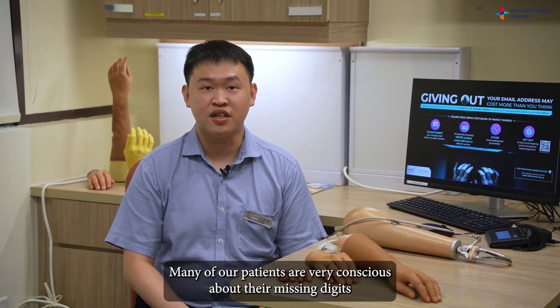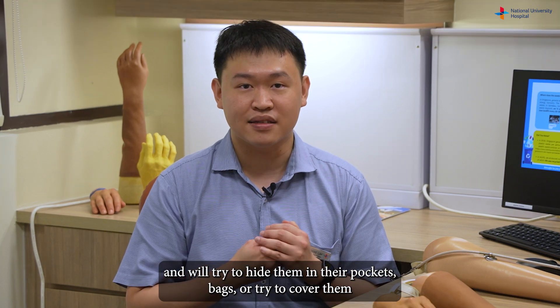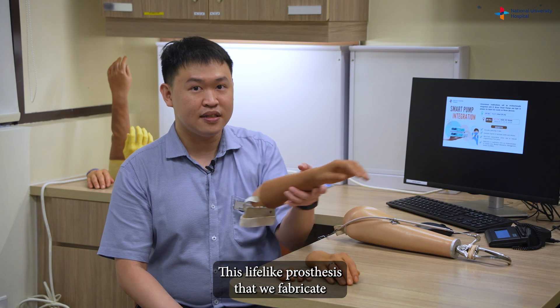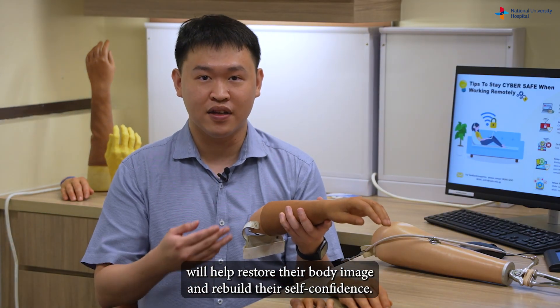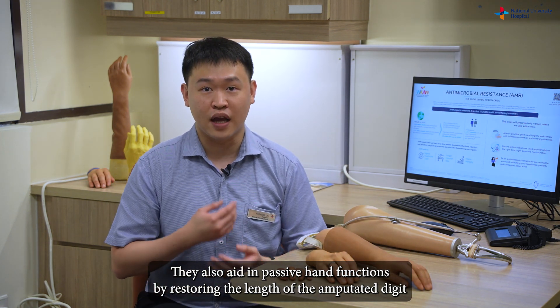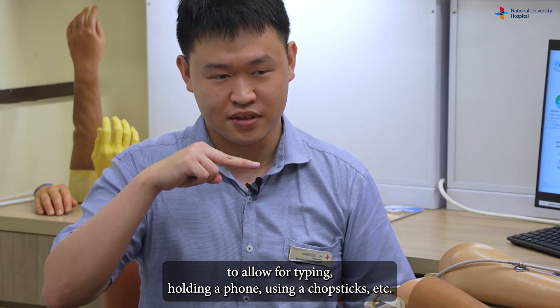Many of our patients are very conscious about their missing digits and will try to hide them in their pockets, bags, or cover them with gloves and bandages. These lifelike prostheses that we fabricate will help restore their body image and rebuild their self-confidence. They also aid in passive hand functions by restoring the length of the amputated digit to allow for typing, holding your phone, using chopsticks, etc.